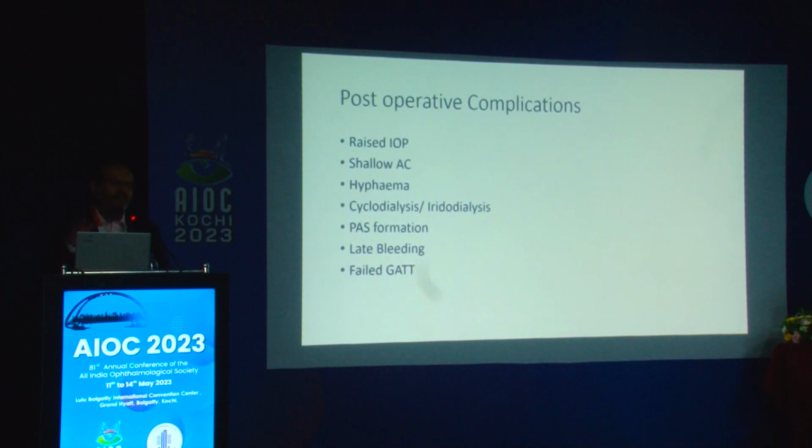Some people have reported that. So if you leave the eyeball soft without viscoelastic, you can have this. We had 2 patients have this. It will present something like an acute angle closure glaucoma, so you'll get into a misdiagnosis, whether to do a PI or not do a PI, and all that. So you have to be very careful. Look at the physiology of the eye and then take a decision.